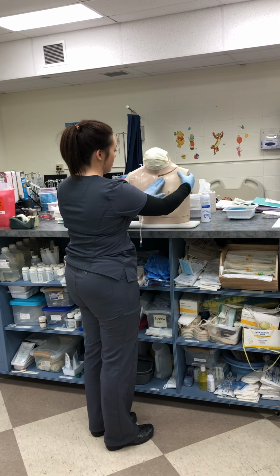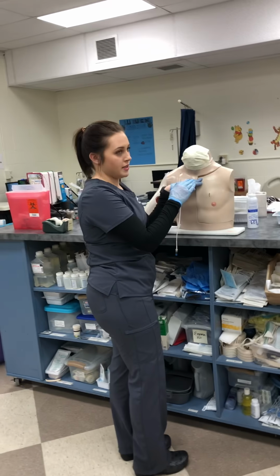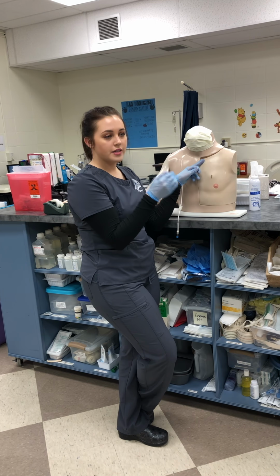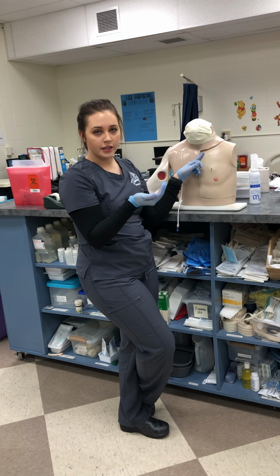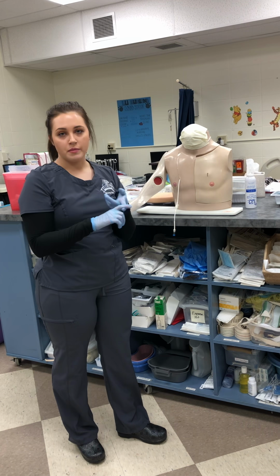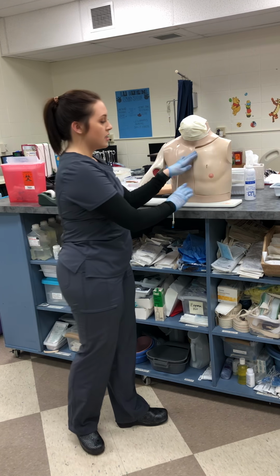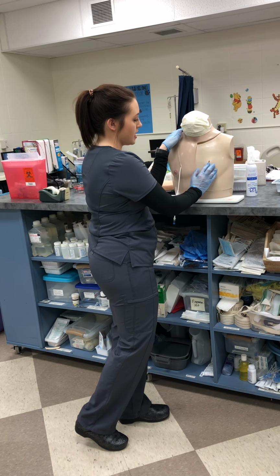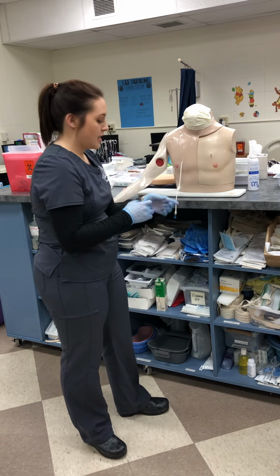Okay, my patient already has a mask on, and the reason is that this is a high-risk area that can lead to blood infections, so we want to make sure that neither I nor my patient increases the risk for that. So now I'm just going to palpate here on the chest, and it looks like my port is right here. So now I'm going to go ahead and take my gloves off.